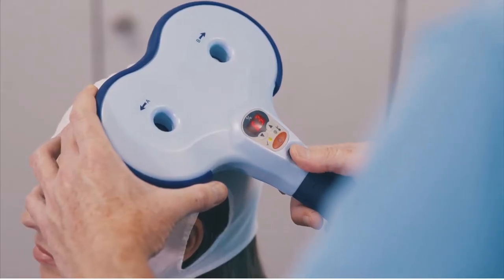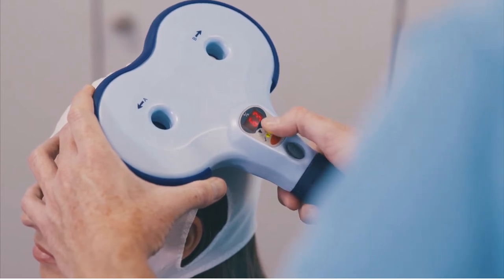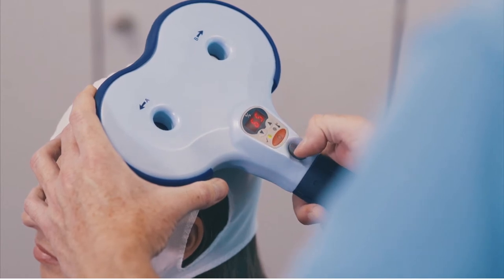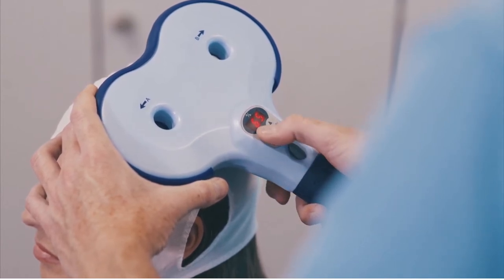Hold both multi-function buttons to deliver a pulse at C3. Watch the patient's right thumb for a twitch. If a twitch occurs in the fingers instead of the thumb, move the coil down slightly and retry.